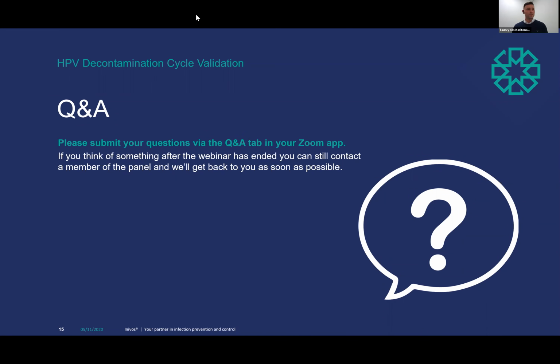Okay, and I think it's important to note, from Enrico's point of view as well, that as soon as you get that validation report, what we essentially mean by that is that we were able to complete the cycle that we validated. So we were able to meet all the target parameters that we had when we did the cycle validation with active live biological indicators. And if we cannot reproduce the same cycle conditions and parameters, we would fail the process. So there's no ambiguity about the success of what actually happened. No, there isn't, and we do actually fail processes.